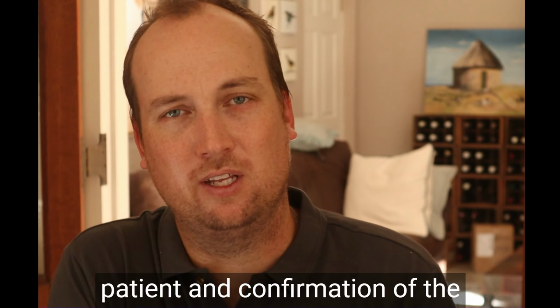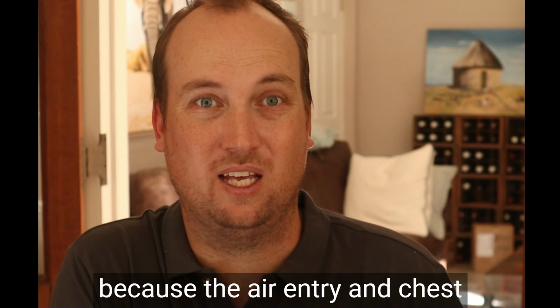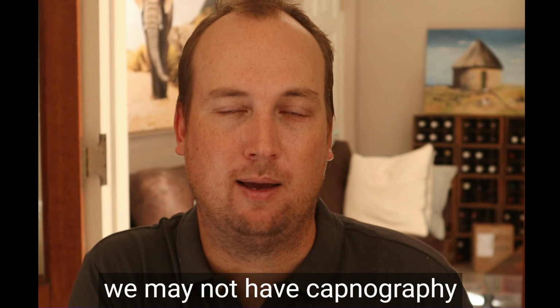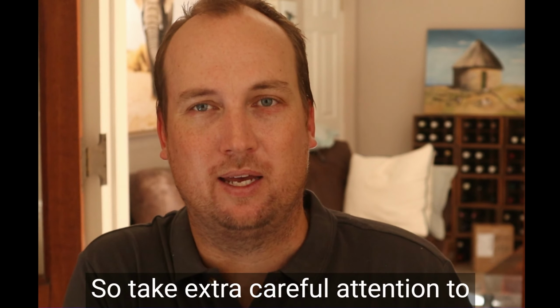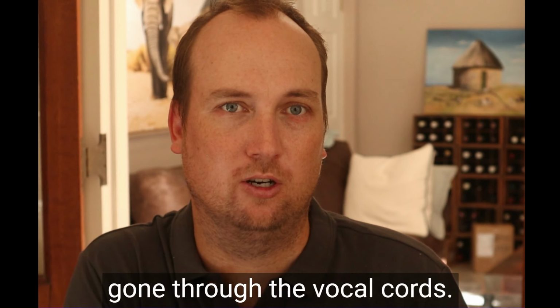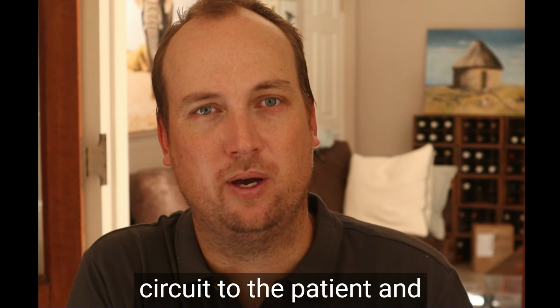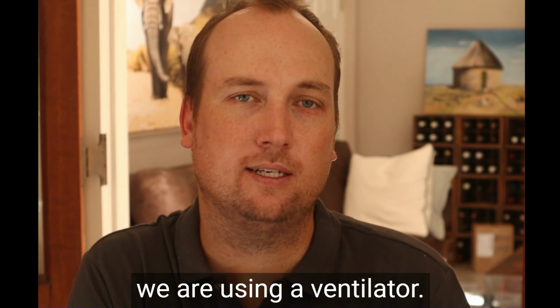And confirmation of the endotracheal tube position here is going to be extremely difficult because the air entry and chest rise are going to be very poor, and we may not have capnography monitoring at the venue we're in. So pay extra careful attention to your intubation and making sure that the endotracheal tube has gone through the vocal cords. We then connect our breathing circuit to the patient and we initiate ventilation if we are using a ventilator.